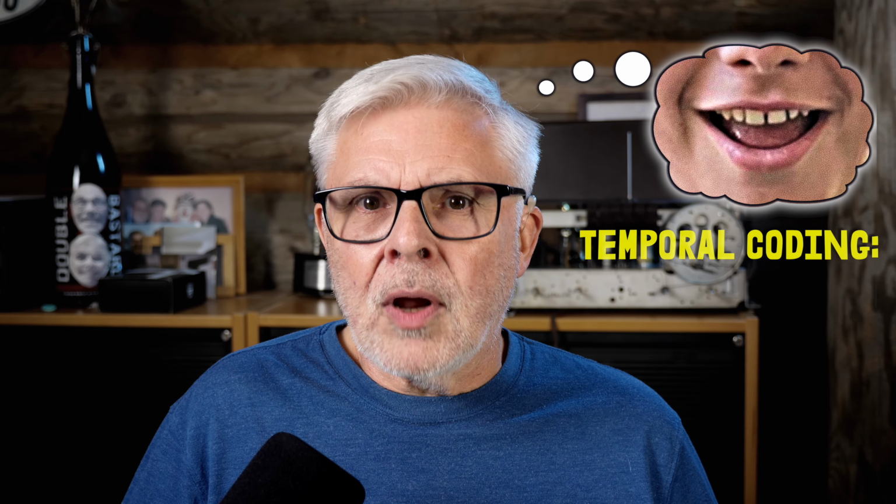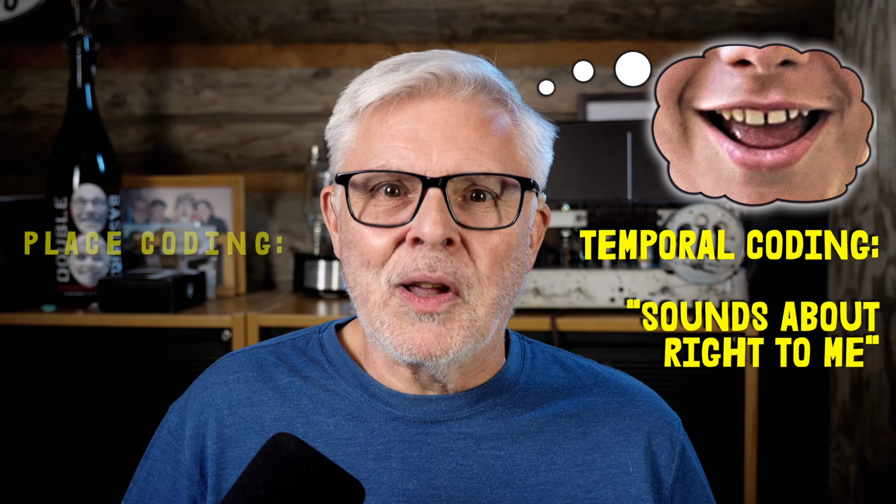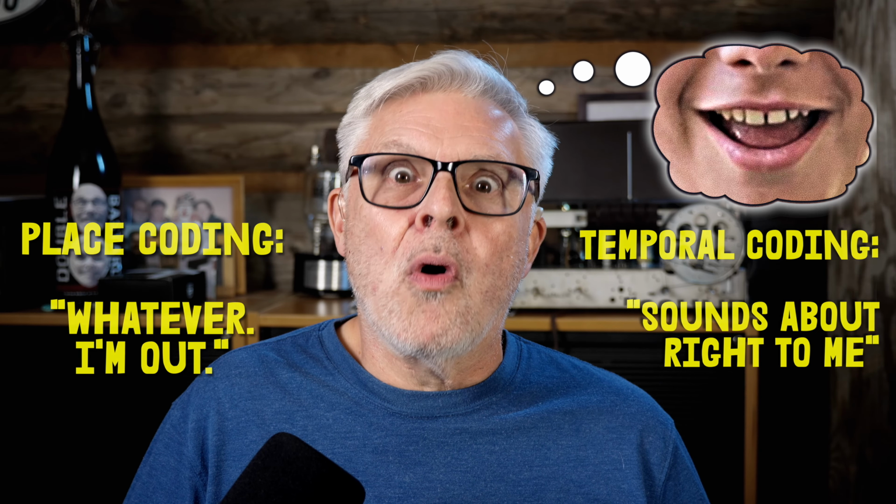If you expect a voice based on memory to sound a certain way and your temporal coding agrees, maybe the place coding part of the brain is just getting tired of arguing and says, "Fine, have it your way. I am so over everyone sounding like a minion." In other words, you learn to tune out Minnie Mouse and you end up being okay with it.